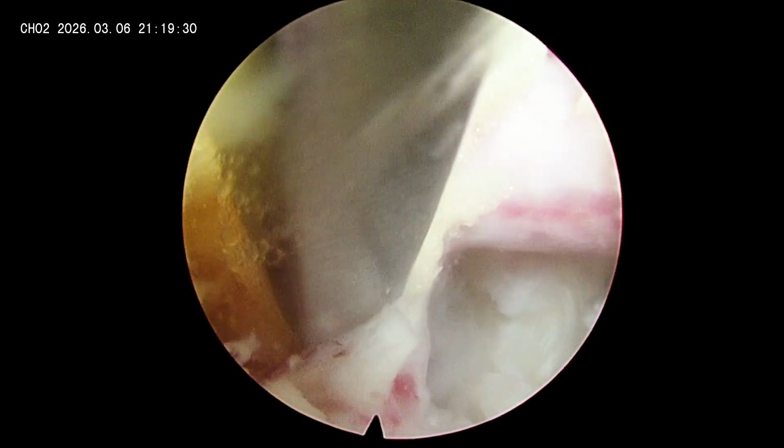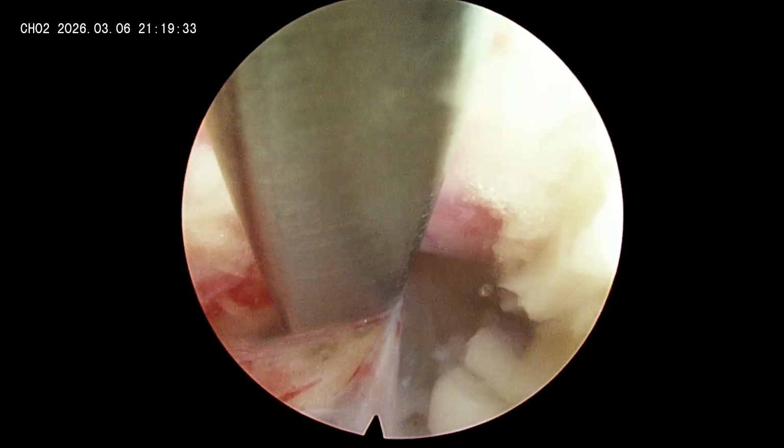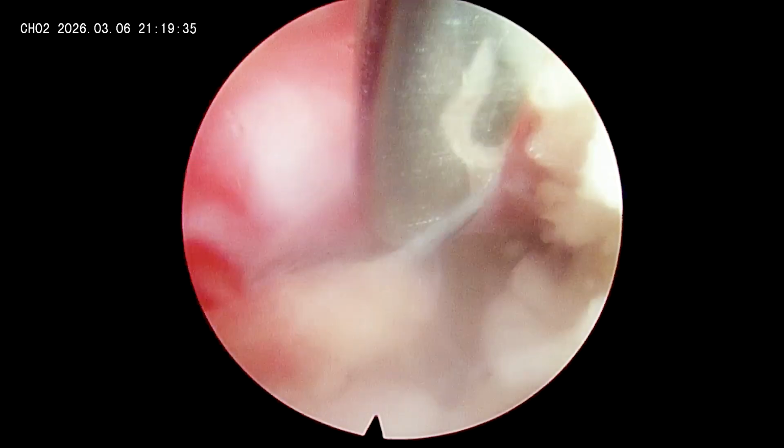You can see here that is the vessel. This is the vessel which is adherent, not adherent, but it is supplying and going to the lateral recess. So obviously the mobility of the root is hampered here. So we'll just cut that vessel and our surgery will be over.